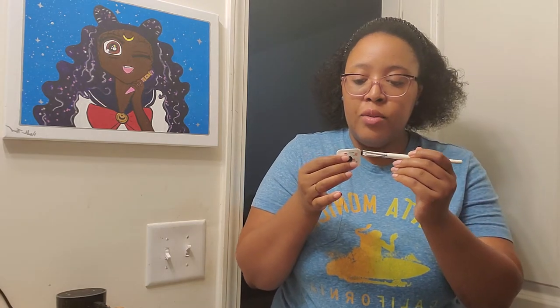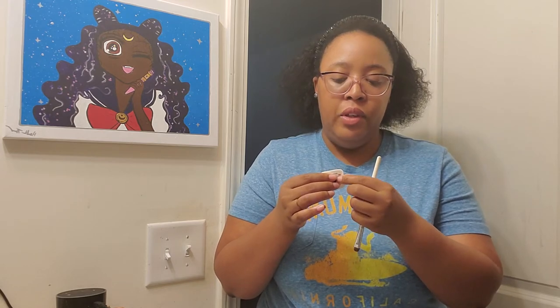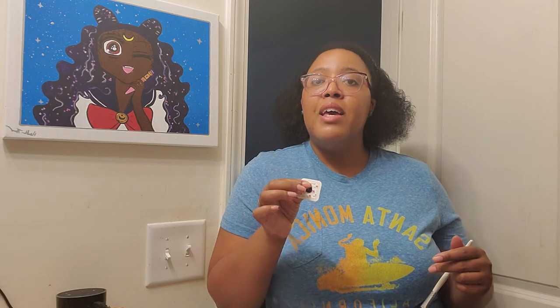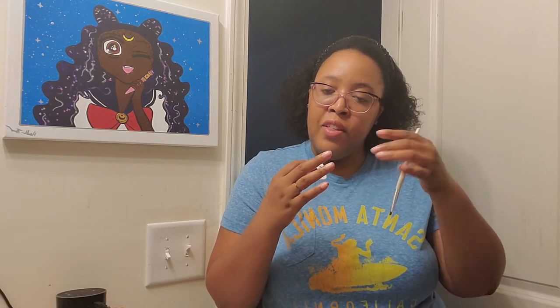You want to get as close underneath as you can, but if it's completely flush, just the side is fine. It's going to lift up a little bit, and then you use some scissors to snip what you can. It's not going to be a lot and it's slow going. I'd recommend using hair shears if you have them because they are less likely to pull on the hair — you don't want that, that hurts. You can actually see when you lift it: there are lots of strands of adhesive just stretching and you can brush those and they snap, snap, snap and open up to the point where you can cut more hair.